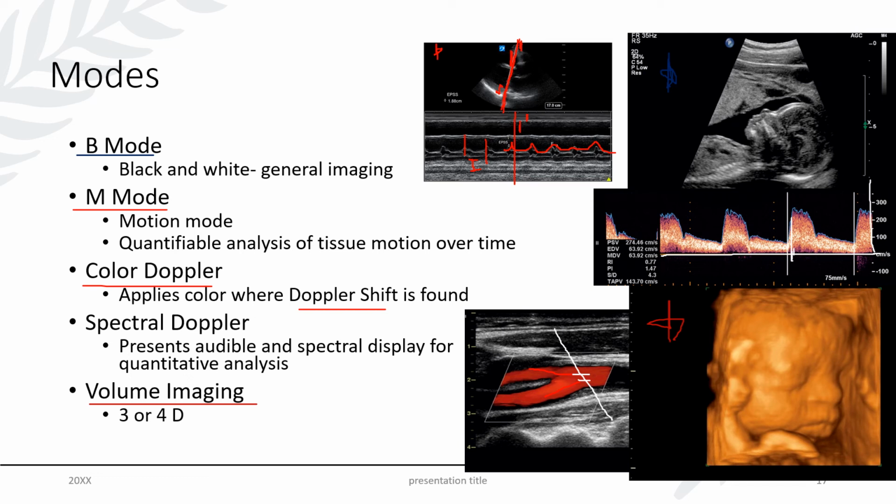From your perspective, as you utilize ultrasound more and more, most point-of-care ultrasound equipments are not going to have 3 or 4D options. Through the Helmsley grant, GBC has purchased some equipment with these options, so if physicians need additional training or are going to have something like this in their office, that's something we can try and help you with. But the more and more you scan with ultrasound, it seems like people become so comfortable looking at things in 2 dimensions that the 3rd dimension really isn't as helpful as you might imagine it would be.